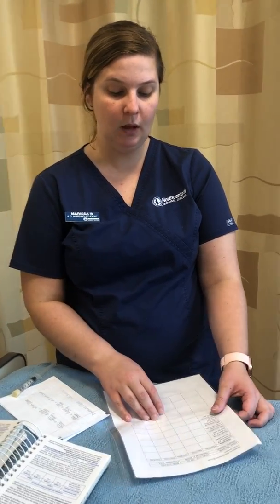His PICC line is currently saline locked, and he is reporting anxiety and rates his chest wall pain at a 2 out of 10. His PICC line dressing is also due to be changed. So based on priority, I'm going to check his orders and his MAR to make sure that he does have a medication to be given for his anxiety. Checking his MAR, he does have lorazepam 1 milligram IV push every 4 hours PRN for anxiety to be given, and it is okay to give it at this time. It's past the 4 hours mark.